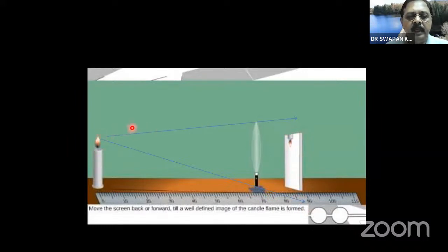If the ray goes to the topmost and bottommost point, this is the maximum size of the image we can get, because it is just close to it. So if it is the PA view, the plate or the cassette will be close to the heart of the patient, so there will be less magnification.